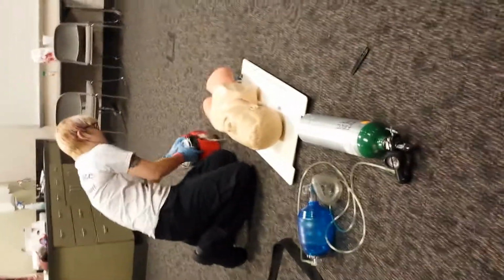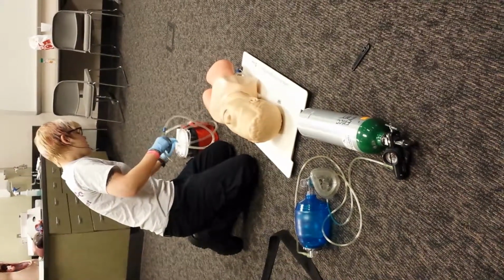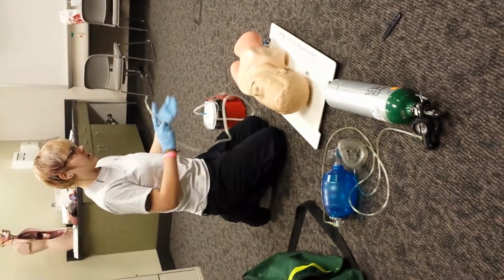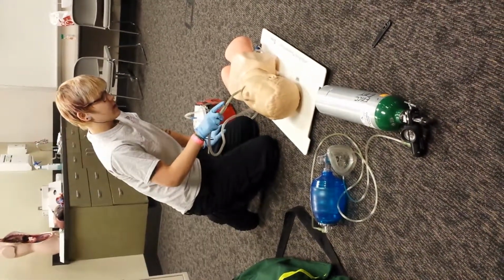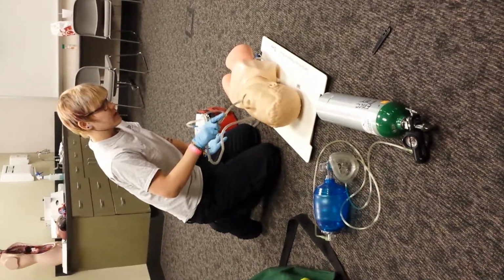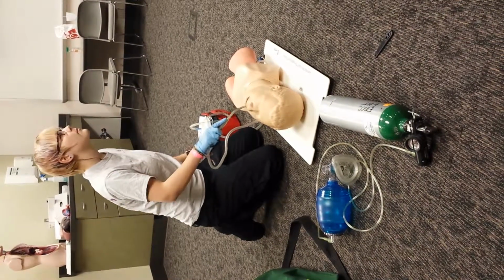I'm going to use a rigid suction catheter. Check it against my glove. I want to insert and suction in circular motions while removing, for no more than 15 seconds. The mouth and the oropharynx are clear.